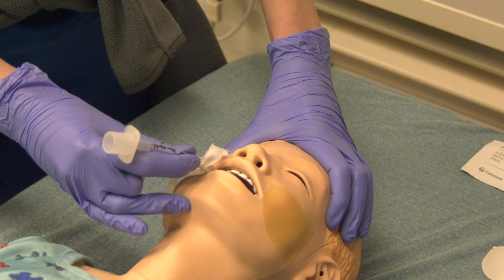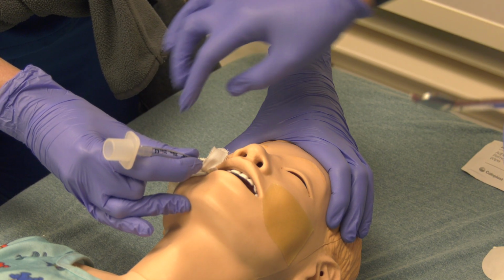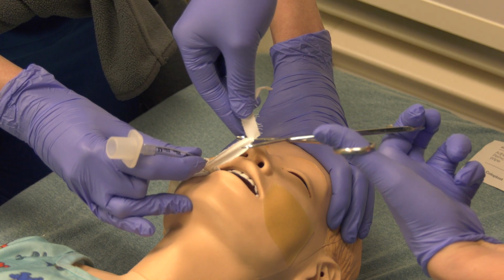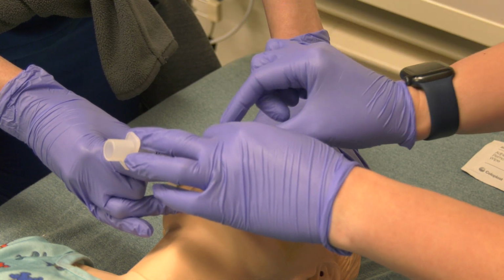And then, I like to make sure that this piece is long enough, because you can always cut it, but you can't always make it longer. And then you will dog ear.